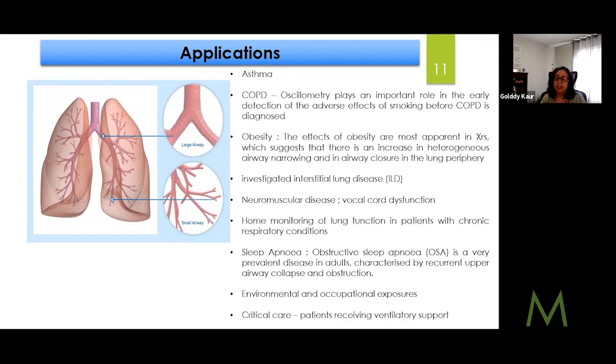So great, I think the idea is great. The technology is a non-invasive way of measuring something. You are averaging it out over three data sets, very quick. So the analysis is going to be a report produced. They can look at the numbers and take whatever clinical action they need to take. But before you go to that level, you need to really show which population will benefit from it, because you have multiple things going on here. So your data needs to be very specific.